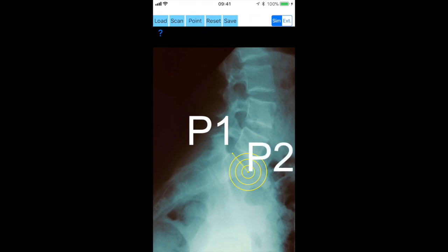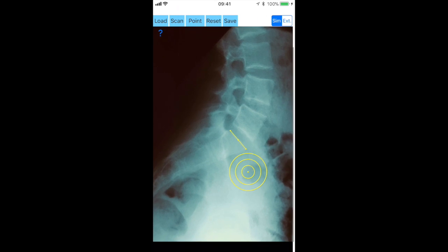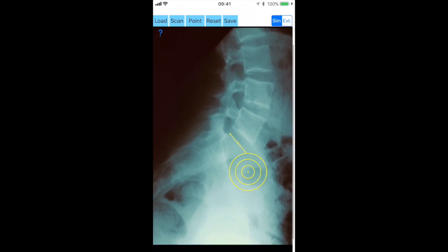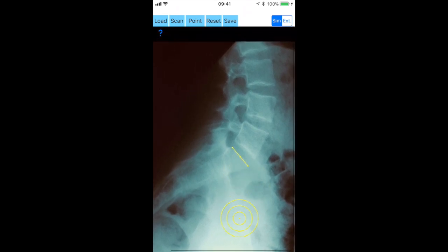Next you aim at the center of the femoral heads, and by clicking the point button you mark the center of the femoral head, C3.